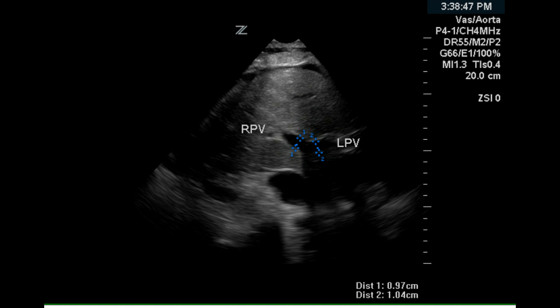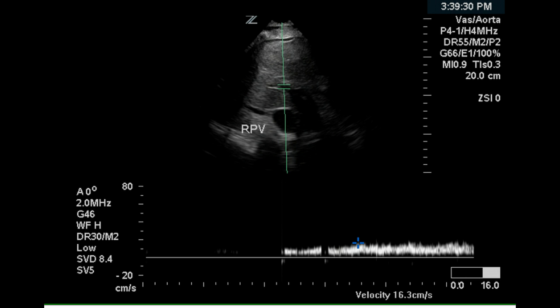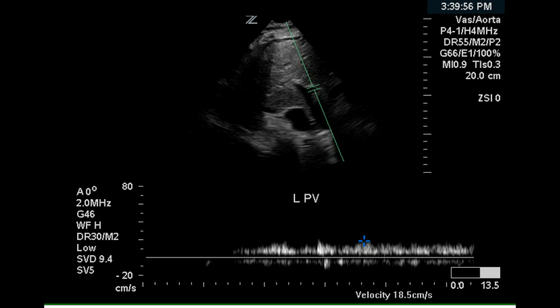The left portal vein is slightly greater than 1 centimeter in size and the origin of the right portal vein on this image is just below 1 centimeter, and these are in the normal range. The right portal vein has continuous flow in the correct direction. The left portal vein also has continuous flow in the correct direction into the liver, hepatopetal.